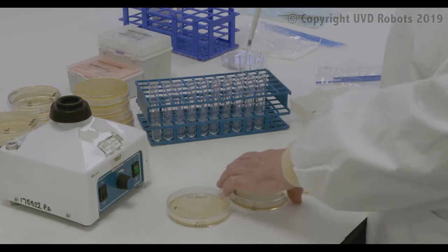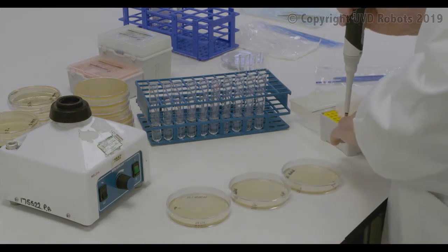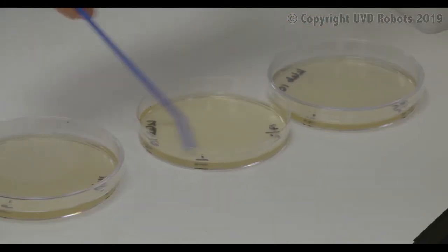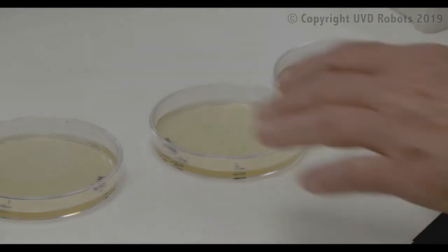What the UV indicators demonstrated in the laboratory sessions was that there was over 1,000 joules given to that area in any 1 minute. So we knew there was plenty of UV light coming from the robot, even in these shadowed areas that we'd set up.